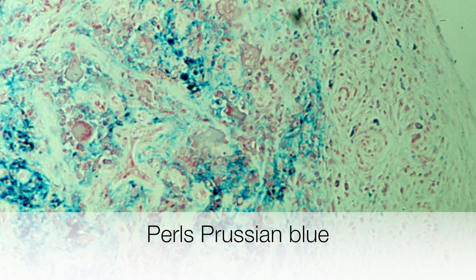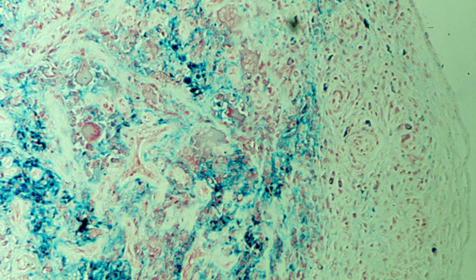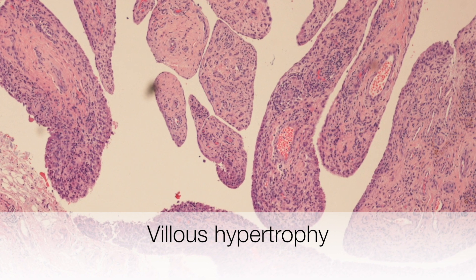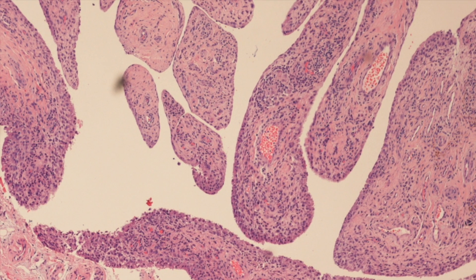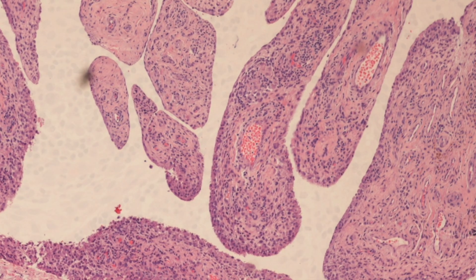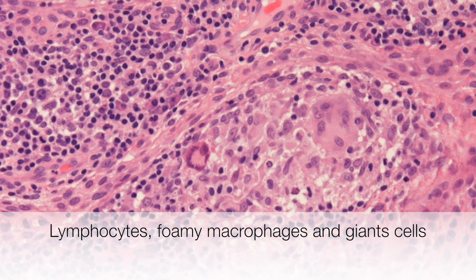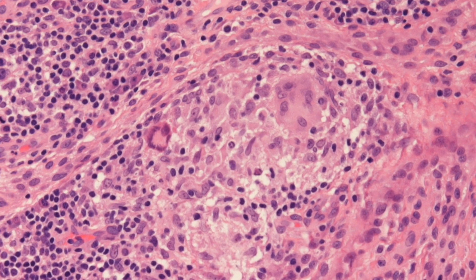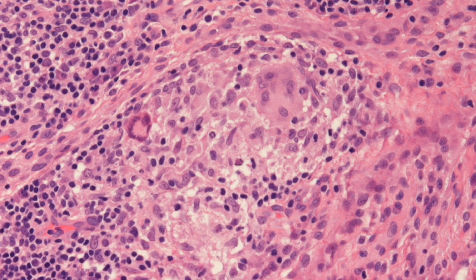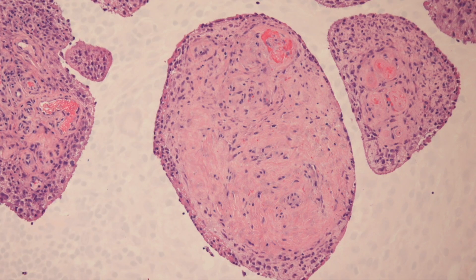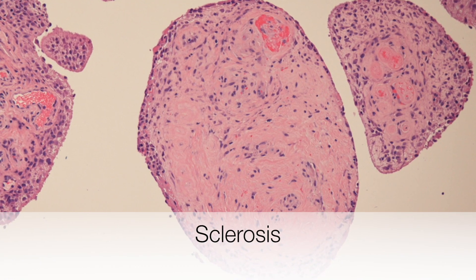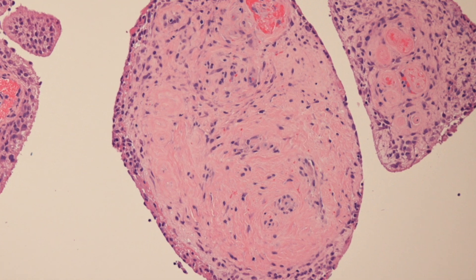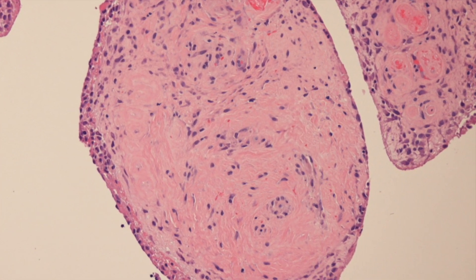Here the haemosiderin has been stained with Pearls Prussian blue. This is the histological appearance of the areas of villous hypertrophy. Here we see a collection of lymphocytes, foamy macrophages and multinucleate giant cells. And finally, here is an area of sclerosis.